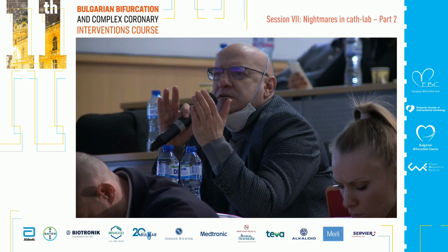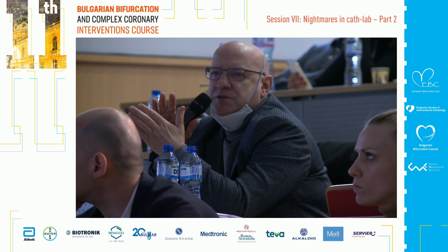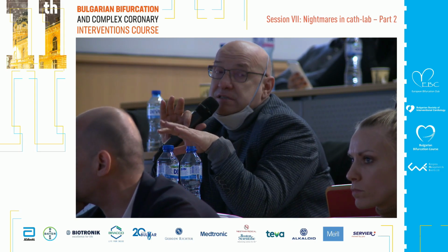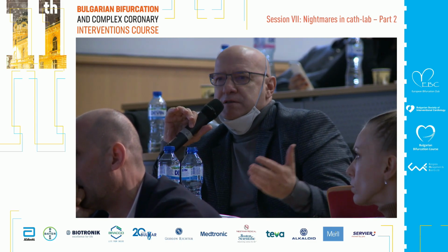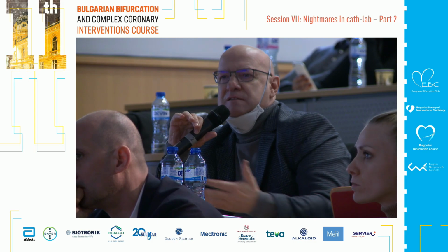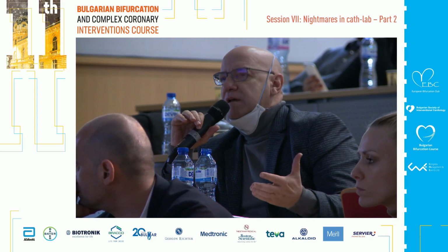I think it will make the companies move toward valves that allow easier access to coronary disease. The valves have almost 10 years of history, and you see how rapidly the age is decreasing. Even now we have a 48 years old man who was already operated, and we are going to put a TAVI on him because the surgeon refused to operate on him again.